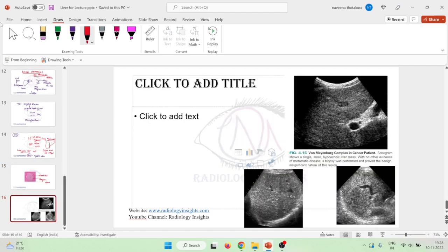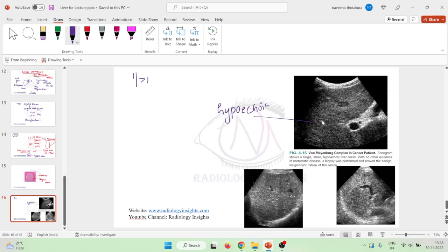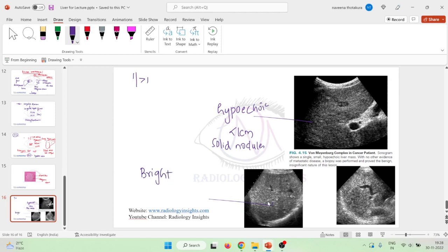On an ultrasound picture, these are either single or multiple and well defined. You can see hypoechoic lesions which are dot-like structures because they are less than one centimeter in diameter, and they are seen as solid nodules. Or sometimes they appear as bright echogenic foci — whitish areas — and these are associated with a distal comet tail artifact.